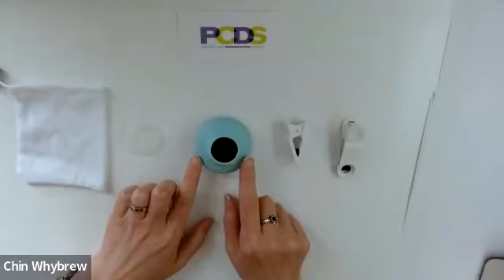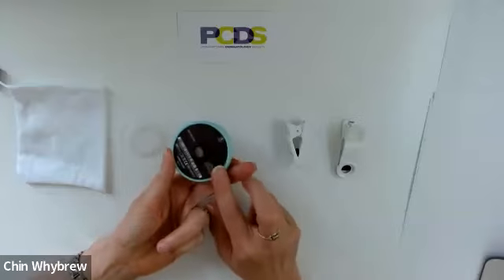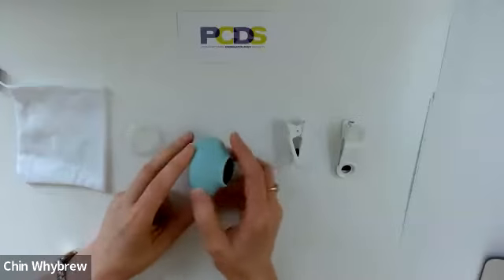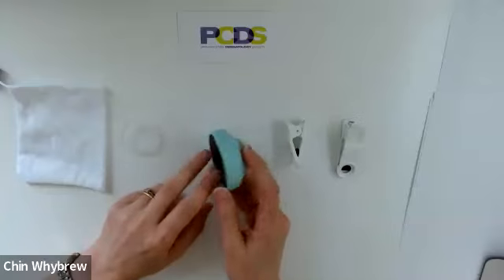This is the Dermlite Hood 2 Dermatoscope. As you can see, it's quite small and it is a fixed focus, polarised-only scope. It's designed to be used with a phone, and only with a phone. As you can see, the piece to look through is very, very small.